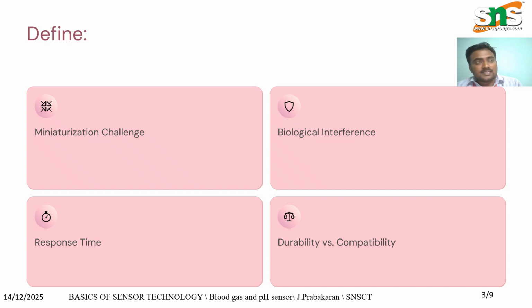The third challenge is response time, which means the result must be available very quickly. The fourth challenge is durability versus biocompatibility. The sensor must last long and be biocompatible. Defining these challenges helps us focus on the real problem.